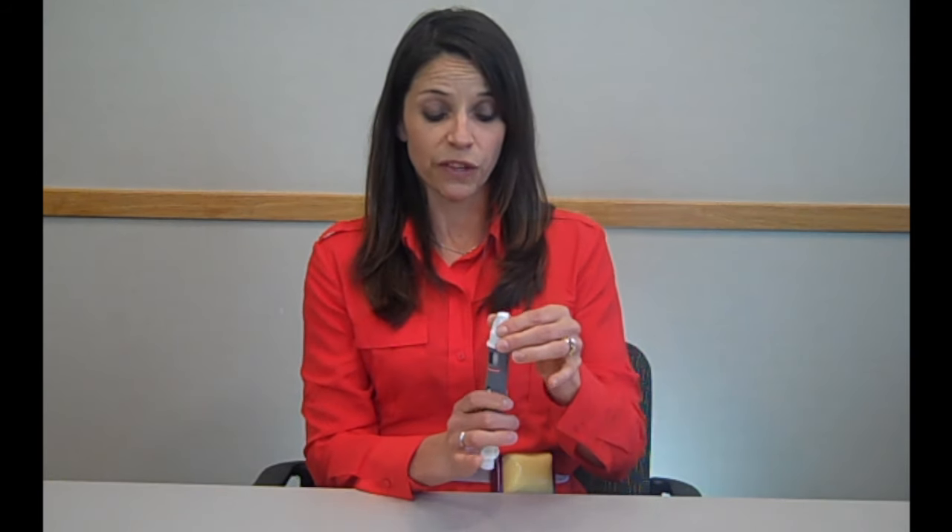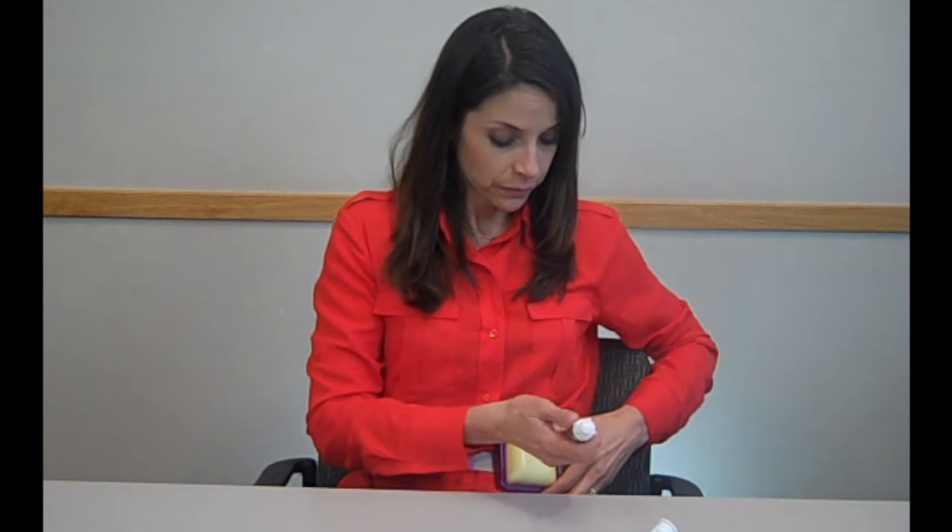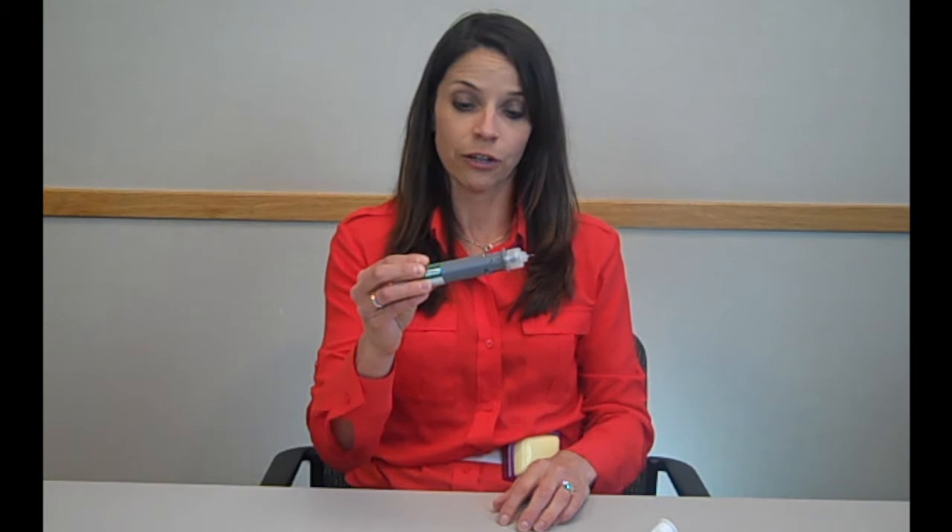Now that you're ready to get the injection, remove the cap of the needle. Take your alcohol swab and wipe off an area of your stomach, if that's what you're choosing to use, about two inches from the belly button. Next, take your pen, inject it into your stomach, and push down on the knob until it stops. Hold it in place for 10 seconds. Then you can remove the pen and throw it into a puncture-resistant container.